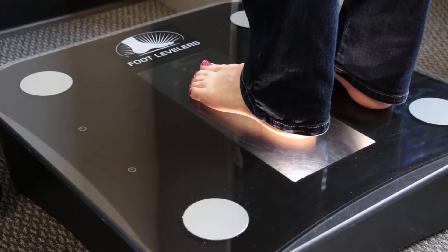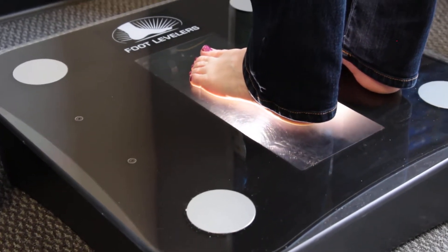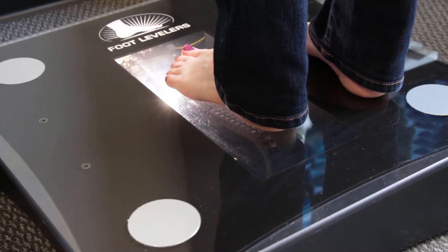Next, it will turn around and do a picture of the bottom of your foot, and with a pressure-sensitive glass, it's able to show us exactly how much weight bearing is on each part of the foot compared to the opposite foot.